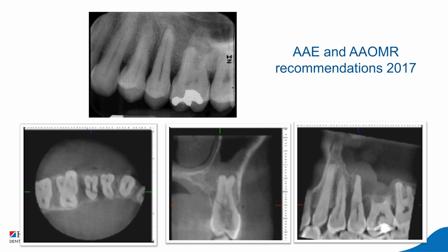There's a lot of things happening in there, internal resorption, extending from the occlusal aspect of the crown all the way to the mid root level. There is also a nice frank fracture line visible on the lingual aspect of the lingual root. And you have periradicular bone loss also on the palatal aspect of that palatal root.